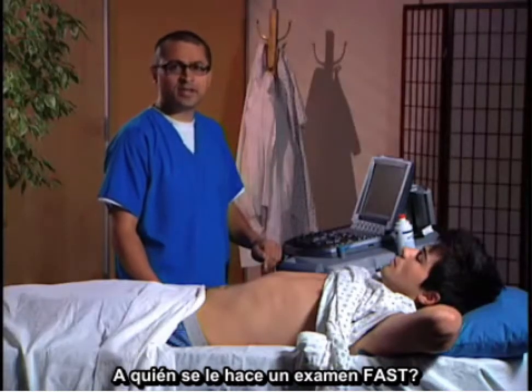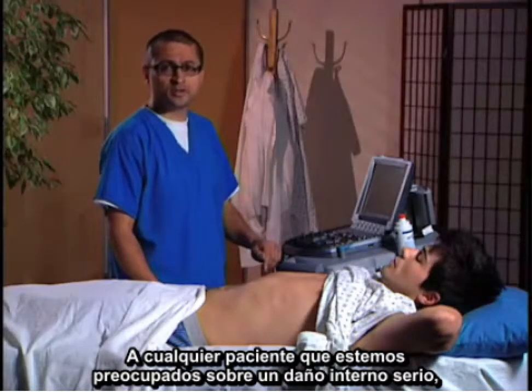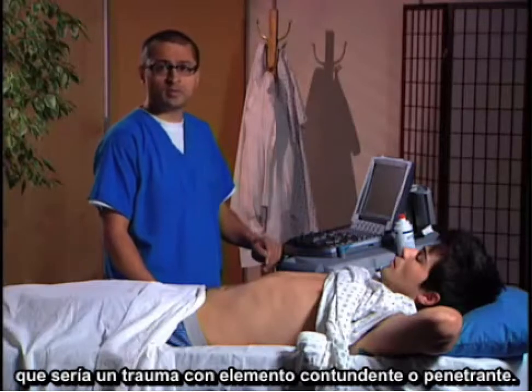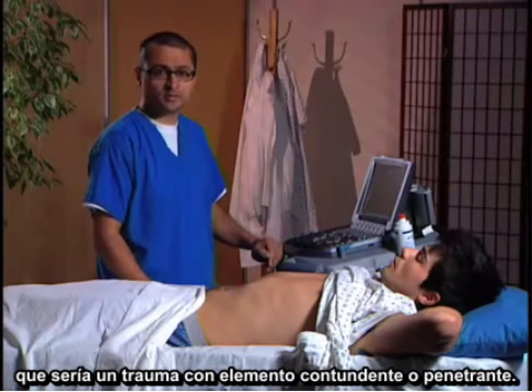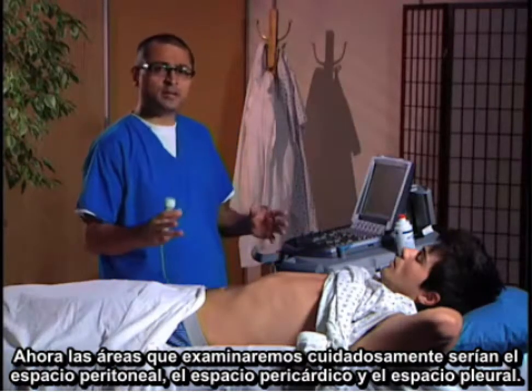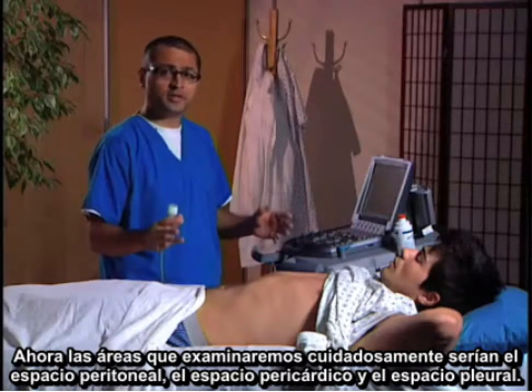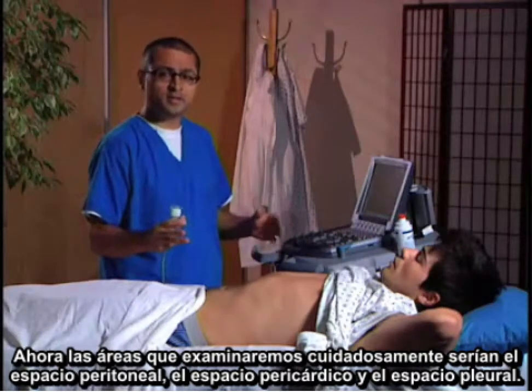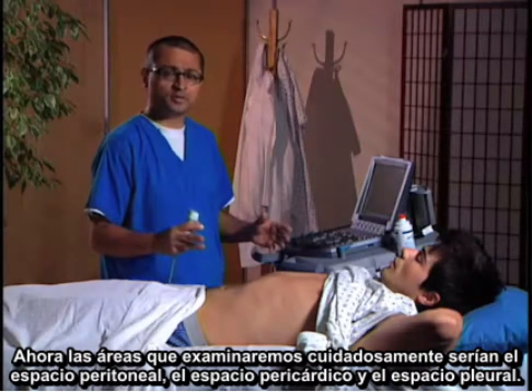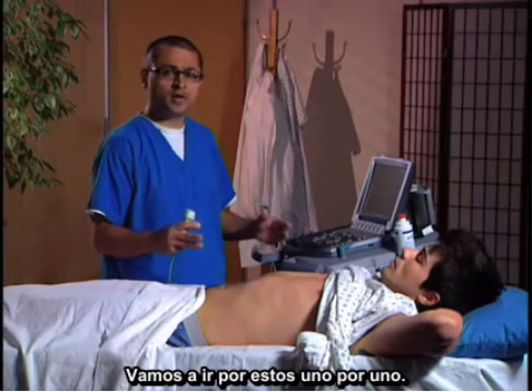Who do you do a FAST exam on? Anyone that you're worried about serious internal injury — that would be blunt trauma or penetrating trauma. The areas we're going to examine carefully are the peritoneal space, the pericardial space, and the pleural space. I'm going to take you through these one by one.